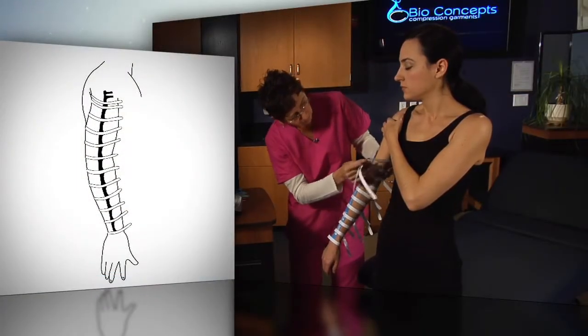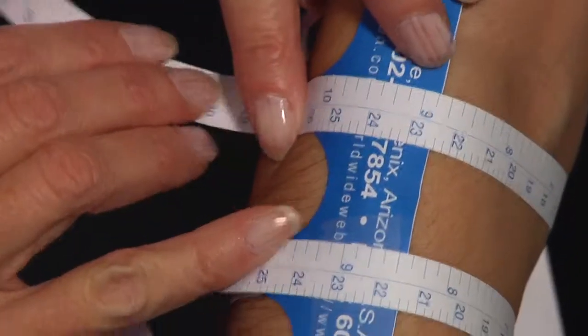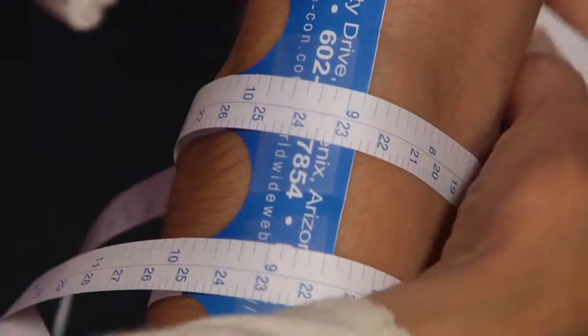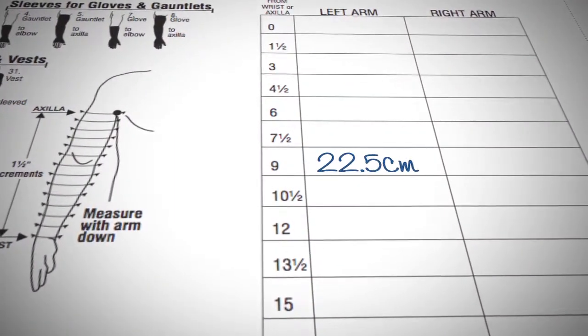Measure the circumference of the arm at every one and a half inch interval from the wrist upward. Read the outside edge of the spine of the tape to determine circumference measurements. Measurements are displayed in inches on the left hand side of the tape and centimeters on the right. Indicate on the form which measurement you are using.